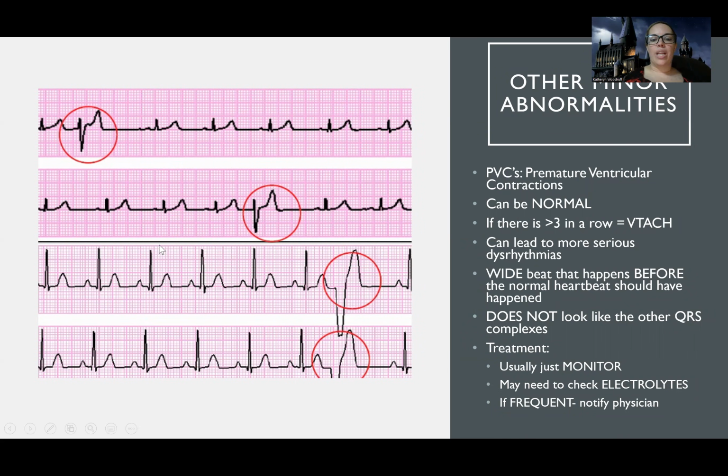So it may look like they're having an extra heartbeat here, but usually there's no actual contraction. There's no actual blood moving forward with this. If there is, it's really minor. So think again, like that toilet flush: if you flush your toilet, then wait 2 seconds and try to flush it again, a little bit might flush, but it's not a full flushing of whatever you're trying to flush down and getting ready to refill. So we do not want these PVCs, because PVCs are effectively those early toilet flushes we want to avoid. They can lead to a lot of serious dysrhythmias.